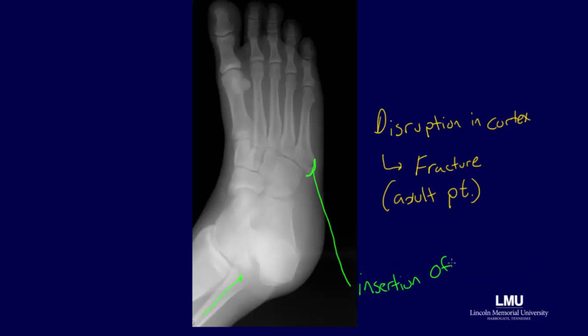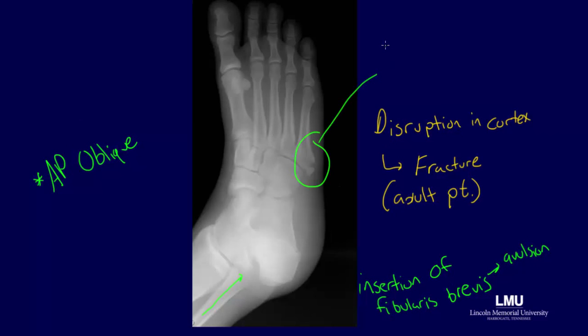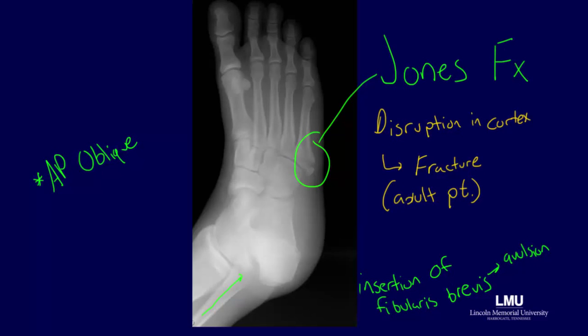Recall that the muscle insertion of fibularis brevis is at the tuberosity of the fifth metatarsal. For this reason, avulsion fractures are also a possibility at this location. While we have discussed a number of different pathologies using this image, remember that this is a Jones fracture.